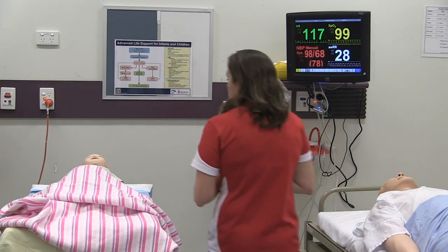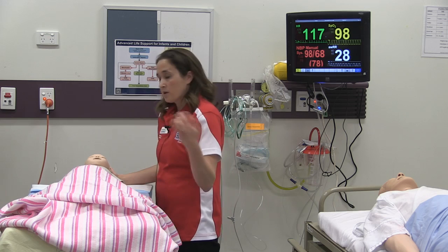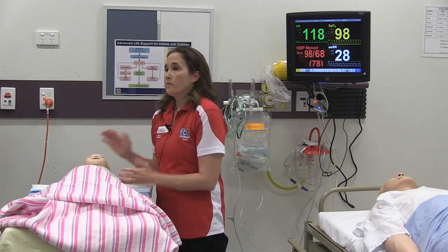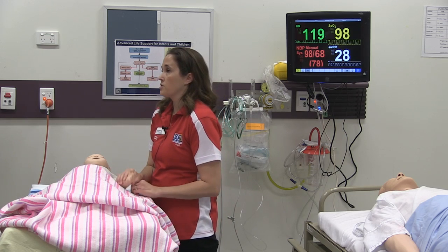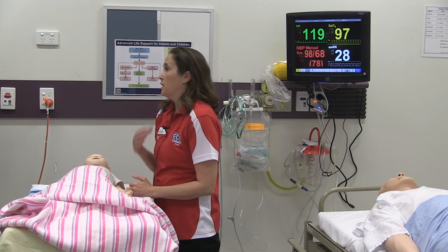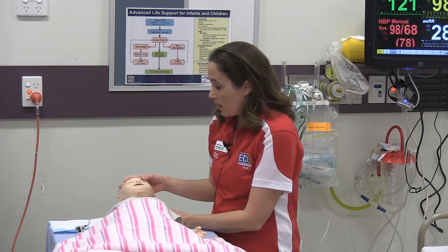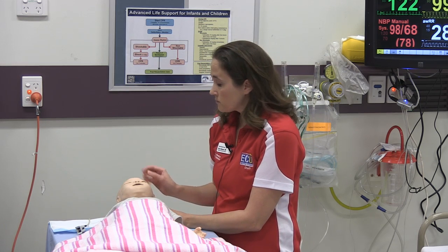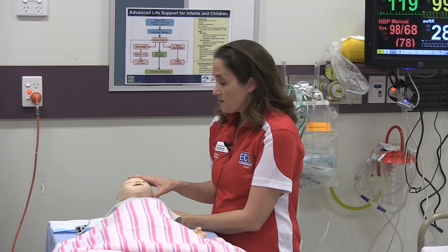I want to introduce you briefly to Laerdal's Sim Baby. If anyone wants to come a little closer, feel free. This mannequin is kind of a medium range mannequin in that it has quite a few capabilities. You were just introduced to 3G, and he blinks and has a lot of physiological capabilities. This mannequin has quite a bit as well. You can see that it doesn't blink, but you can change the pupils out manually. You can have a bulging fontanelle if you want, or a sunken fontanelle.